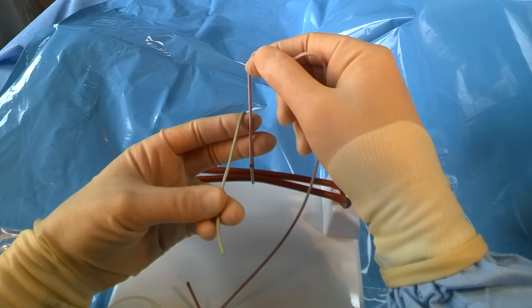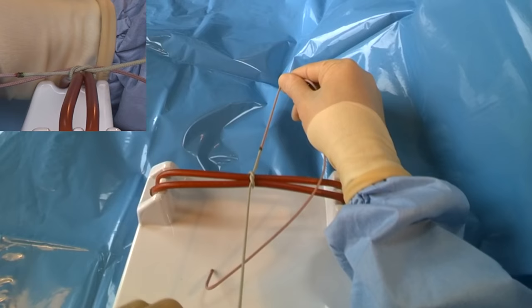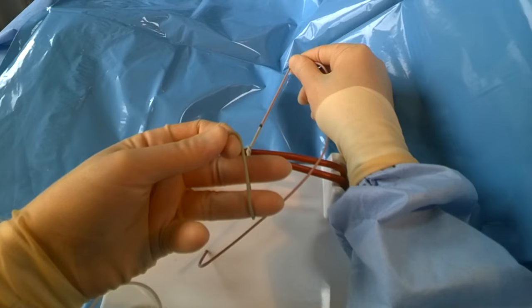Essentially all we're going to do is bring the short thread over and then under and down, and that's to create a reef knot. Then we're going to come back up the other way, so this time holding the short thread between my thumb and first finger.